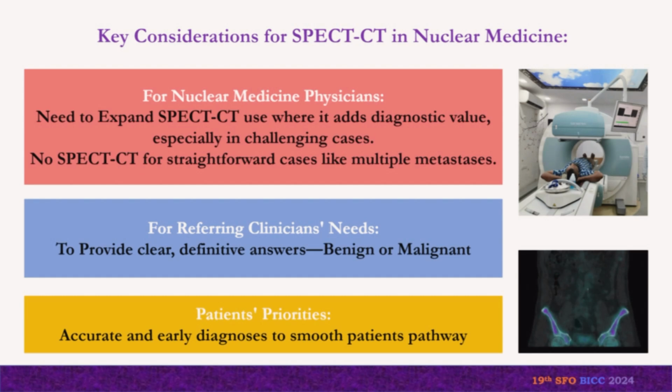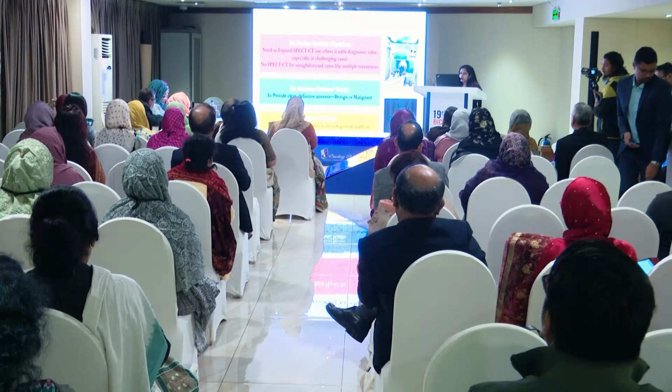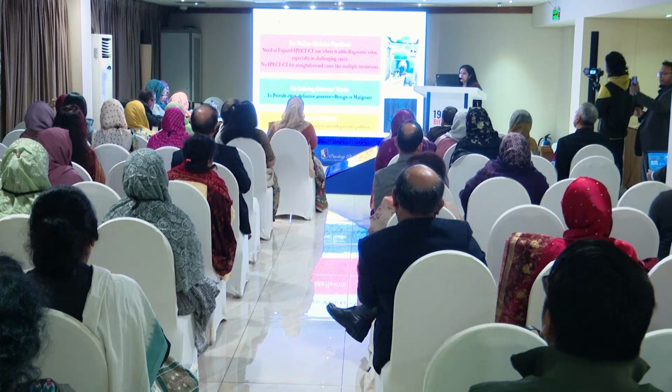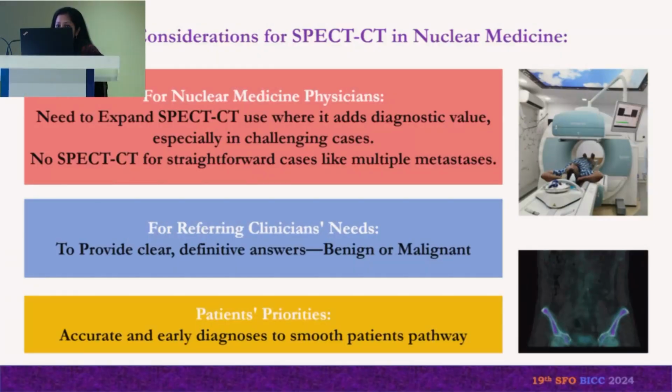Before that, I want to mention that there are some key considerations for SPECT-CT in nuclear medicine. First of all, for the nuclear medicine physician, then for referring clinicians' needs, and of course the patient priorities. Nuclear medicine physicians need to expand the SPECT-CT use where it adds diagnostic value, especially in challenging cases, and no SPECT-CT for straightforward cases like multiple metastases. For the referring physician, we need to provide a clear, definitive answer, that means benign or malignant, and of course accurate and early diagnosis to smooth the patient's pathway.